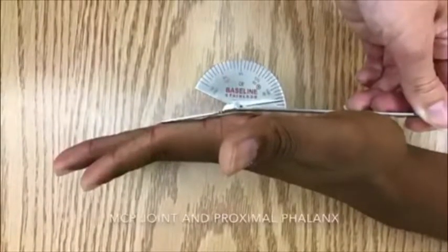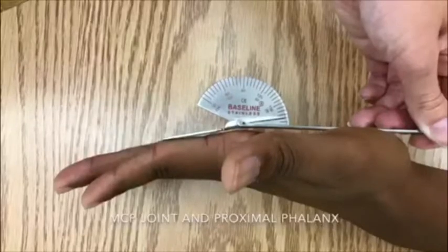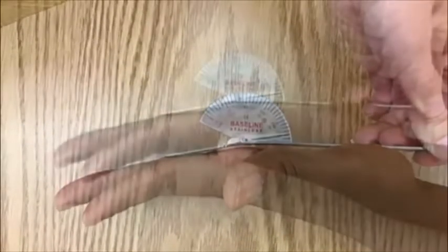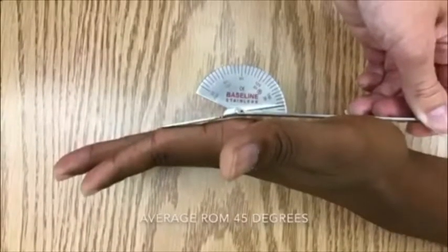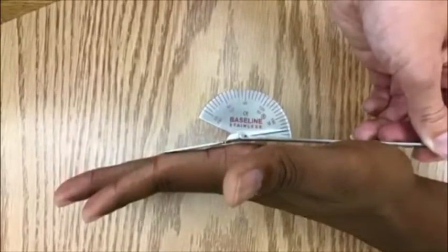Have the patient extend their fingers. Adjust the movable arm of the goniometer so that it is parallel to the longitudinal axis of the proximal phalanx. This patient measures at 10 degrees of extension. Average range of motion is 45 degrees.